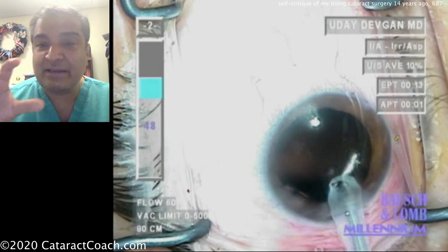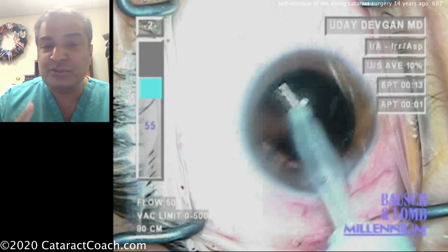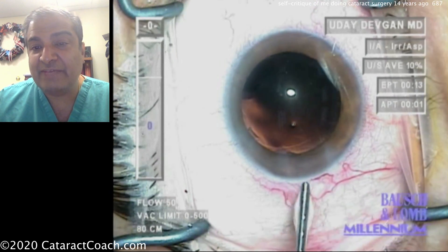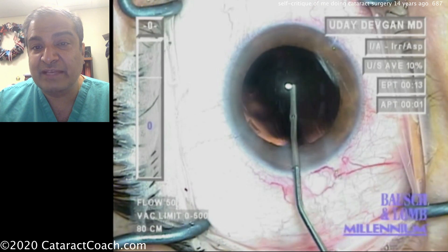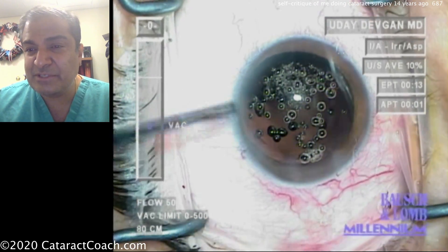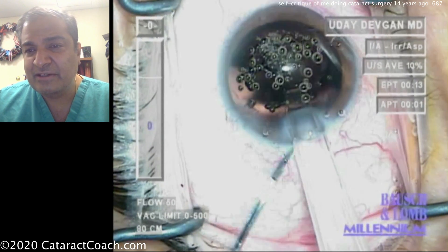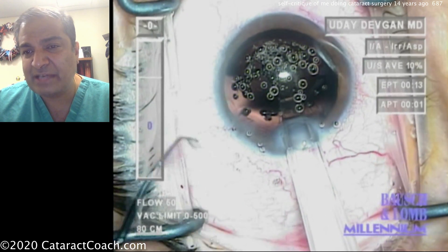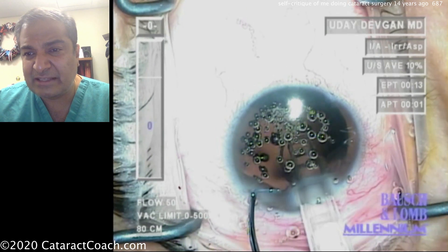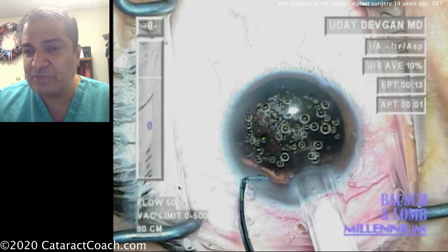The microscope view here is not as good as we have today — today we have a much stronger red reflex. Also the video is standard definition; in the modern era we use high definition videos. Here's the viscoelastic filling up the capsule bag — a few bubbles there. The viscoelastic looks like HPMC, hydroxypropylmethylcellulose. You should probably flip that around to the chopper side to get a good grip here. A three-piece lens is being placed in the capsule bag, and the case is going pretty reasonable.